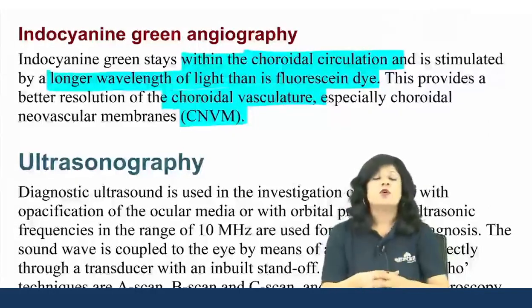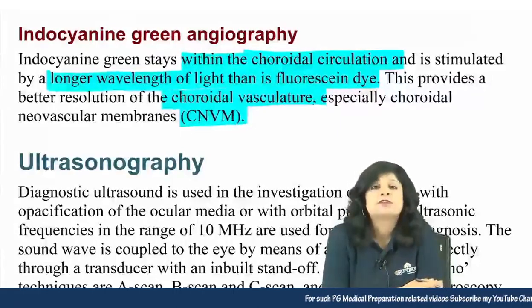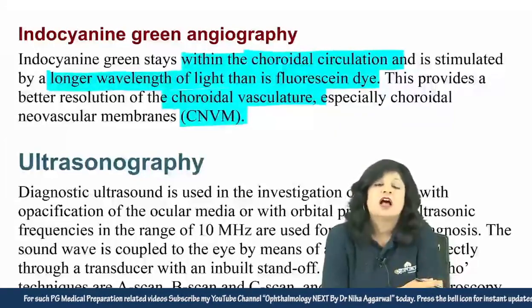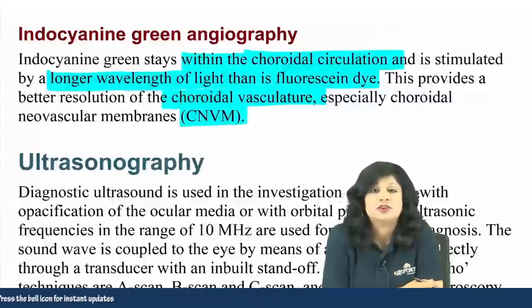So I hope you had a clear insight about some of the important investigations starting from specular microscopy, anterior segment OCT, ultrasound biomicroscopy, fluorescein angiography, as well as indocyanine green angiography.